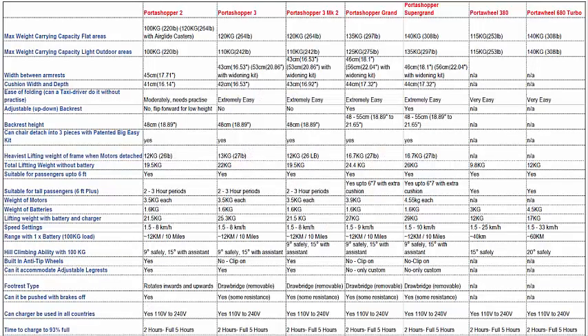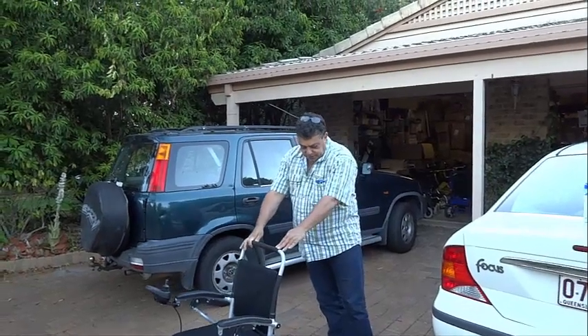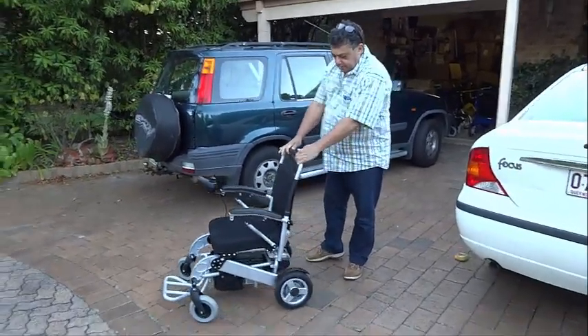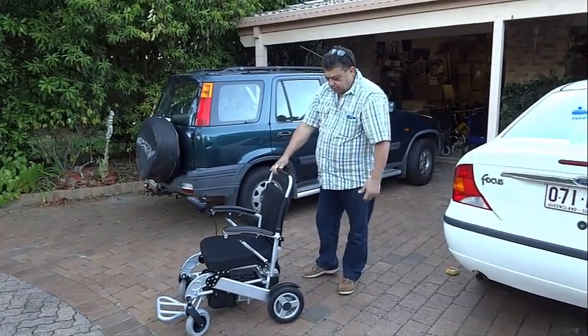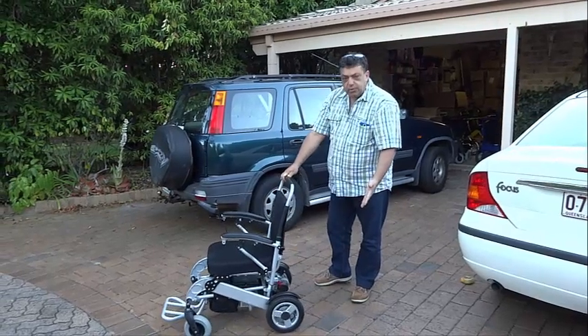For those who need more space, comfort, and weight carrying capacity, we move over to the PortaShopper Grand. It features more powerful 250W motors capable of carrying passengers weighing up to 135kg or 297 pounds. It has a seat width of 43cm or 17 inches and a distance between armrests of 47cm or 18.5 inches, which can be increased to 57cm or 22.5 inches by adding the included widening kit.